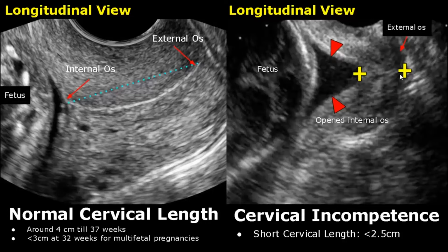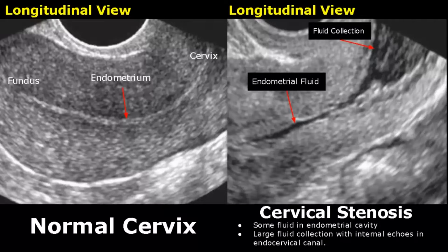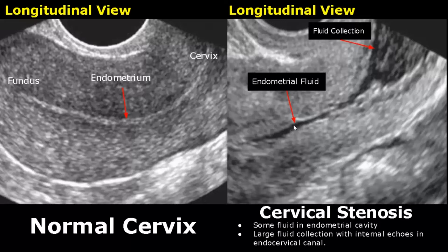Visually, we can see that the cervix here is much shorter than in the normal image, with the fetal head visible. Cervical stenosis is the abnormal narrowing of the cervix — it is difficult to diagnose on ultrasound, but we may see endometrial fluid and a large fluid collection with internal echoes in the endocervical canal.